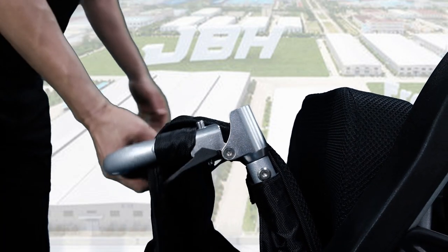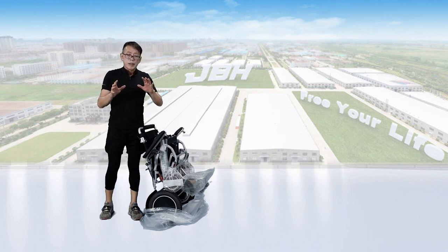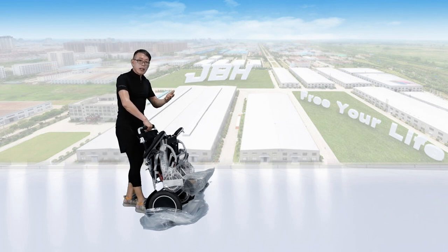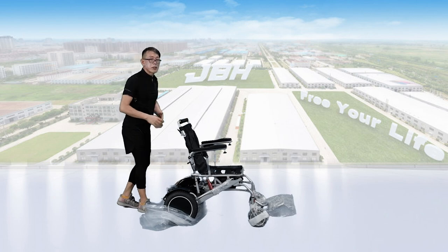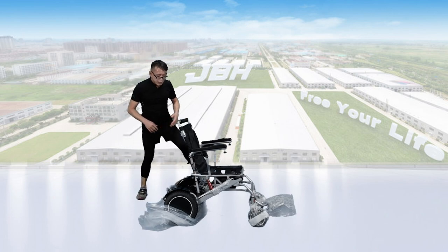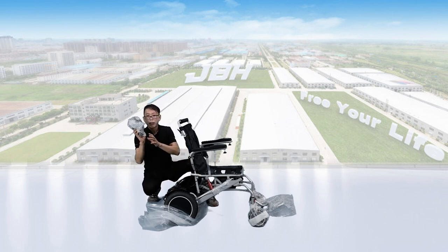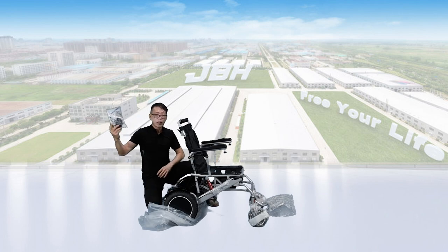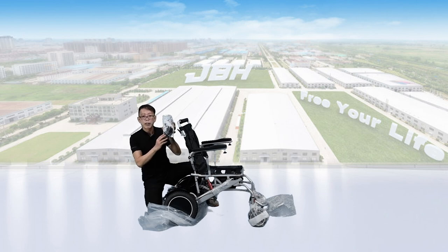Just lift up the backrest — it's a special mechanism — until you hear a click sound and it's all set. Then hold the top of the seat back and open up the wheelchair. Then unzip the storage bag, and you'll find the controller and a user's manual pack with a safety belt and some simple tools available for future use.